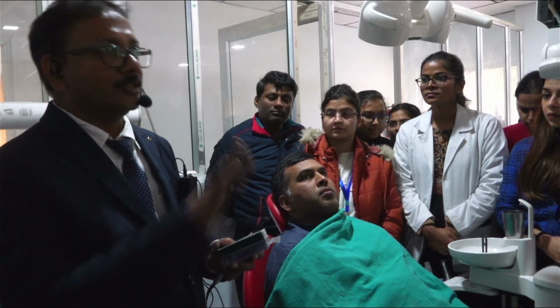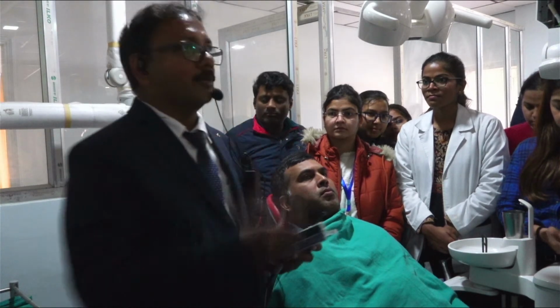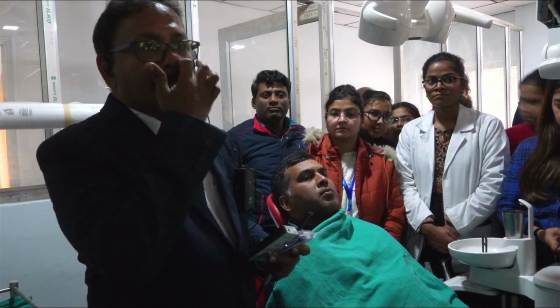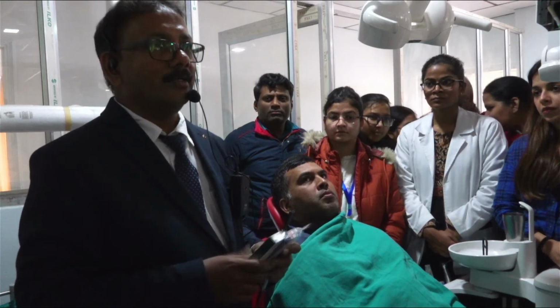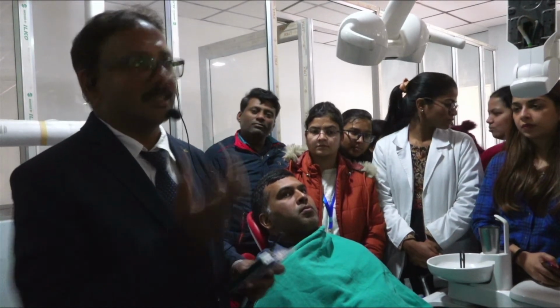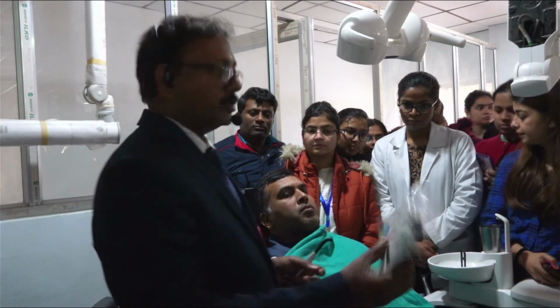Make the patient very clear what you are doing, and rather he must not blame you, कि आपने पहले क्यों नहीं बोला ऐसे मुझे. After doing a PDT, you can irrigate with the water, but you can't completely remove that stain that lingers for a longer time, right? So which one will start?